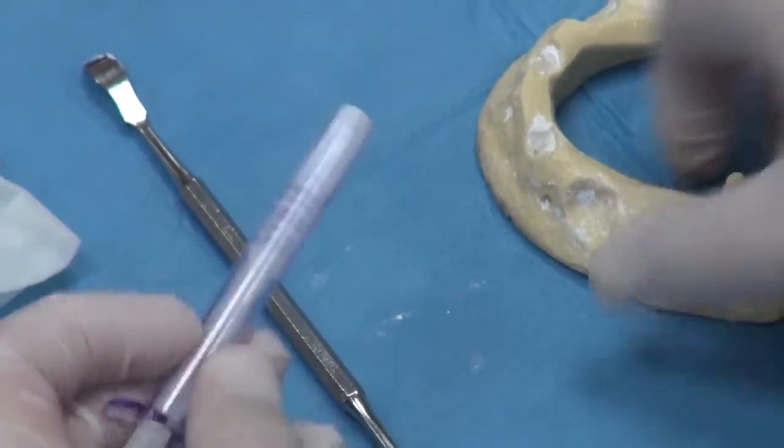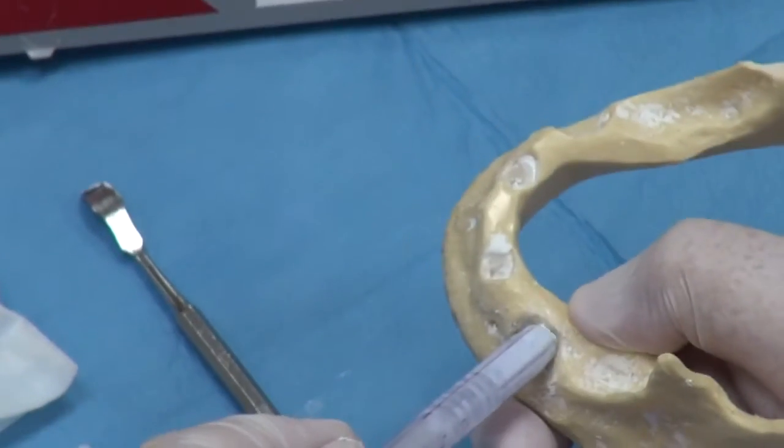Remove the cap, eject the material into the graft site, and we're almost done.